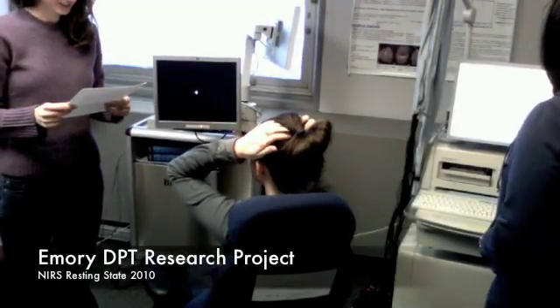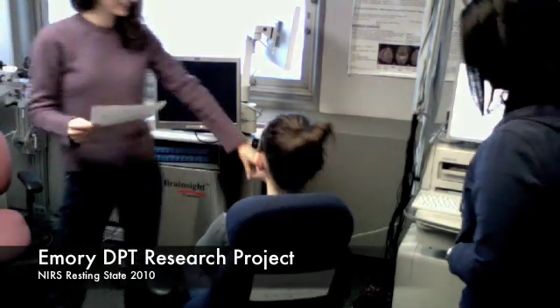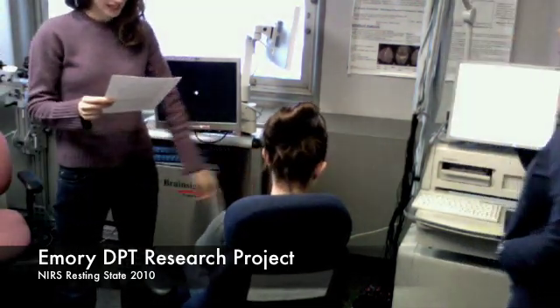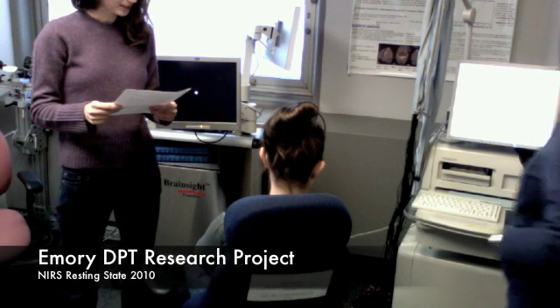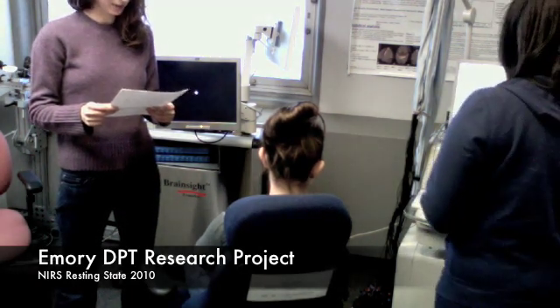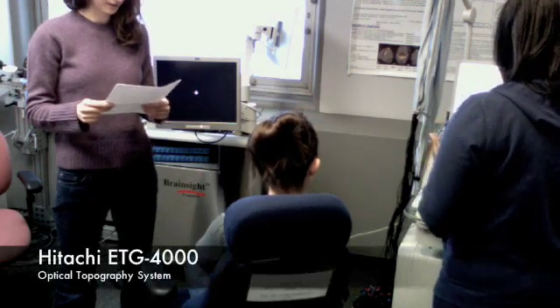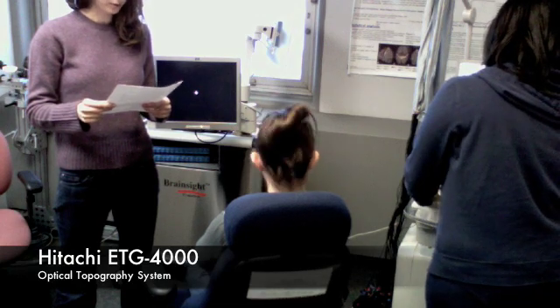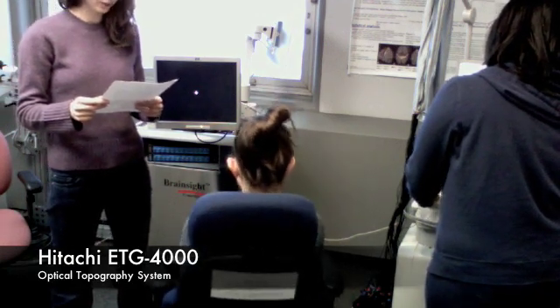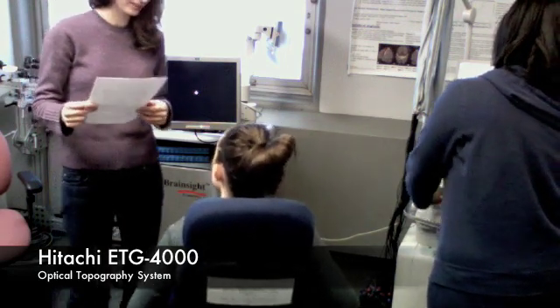Everything we say is scripted, and we're going to be instructing you throughout this process. We're going to put this cap on your head and then attach individual optodes in each of the holes in the cap. You need to remain seated and upright throughout the entire recording session. We ask that you keep your eyes forward, feet flat, and your hands resting comfortably in your lap, unless told otherwise. It is important that you remain as still as possible throughout the session.